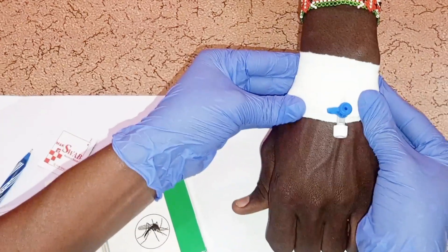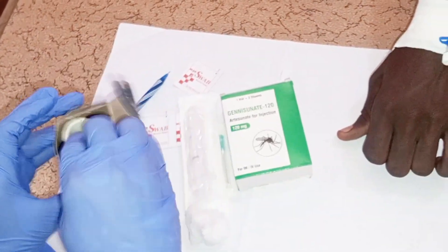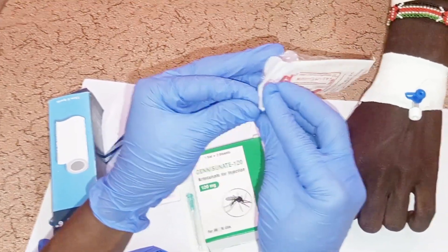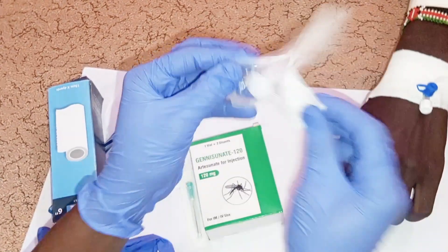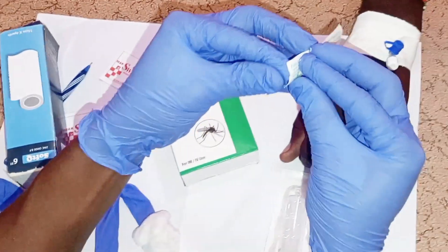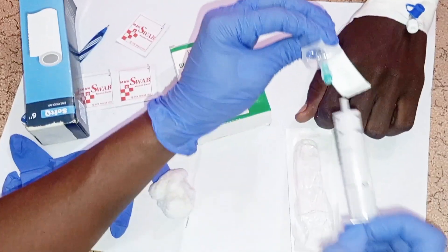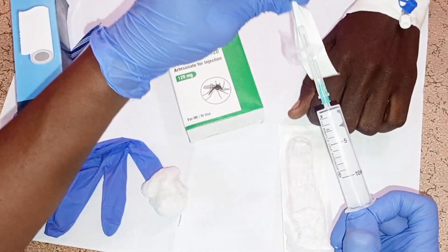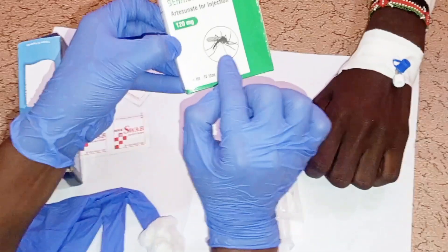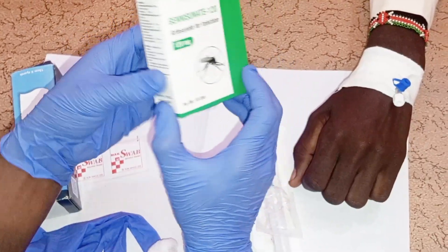After securing the cannula, prepare the drug for administration. Get a syringe, remove it from the manufacturer's packaging, place it on the working bench, then get a 21-gauge needle from its packaging and attach the syringe to the needle. Then get the artesunate for injection and check the labeling — confirm the name of the drug and the dose.